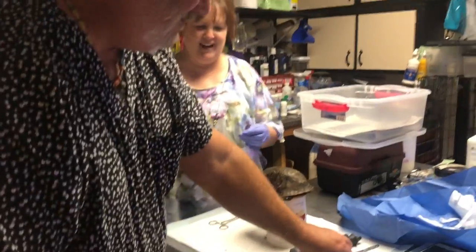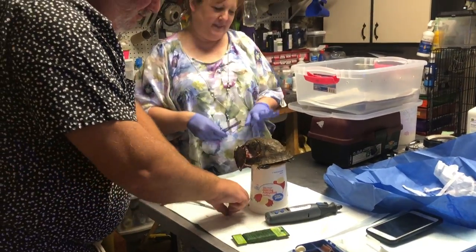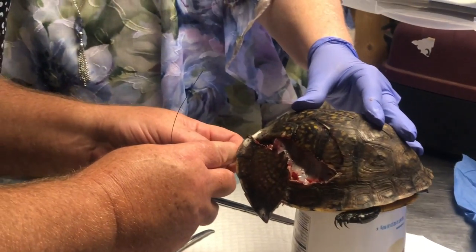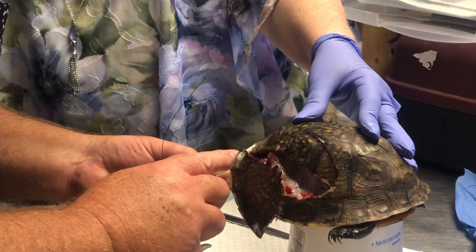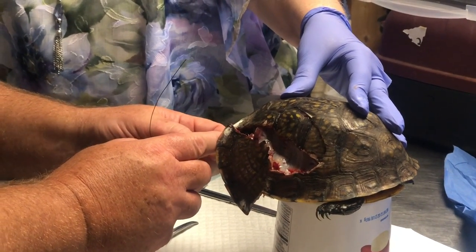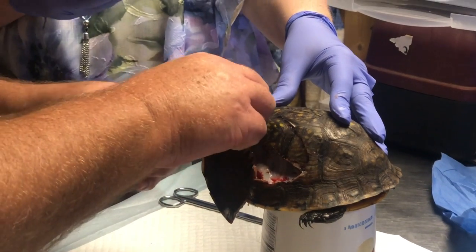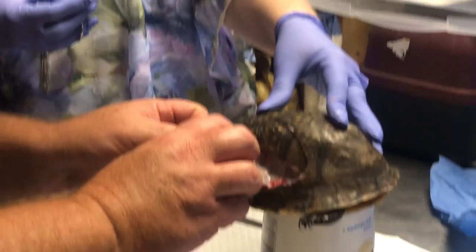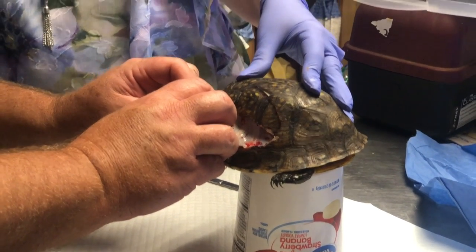How's that for cool? I'm over here cutting my gloves — I'm impressed by how sharp these things are. Yeah, you're a strange creature. Just need more light in here. When's next door going to be ready? Hopefully very soon — our builders are delayed just a little bit, but not much. This is going to be fun, we're going to do this all day every day.